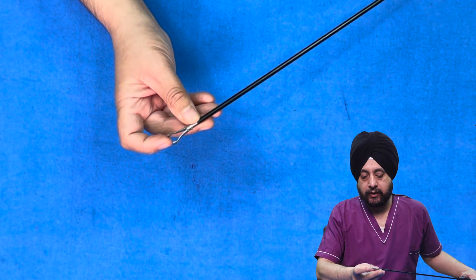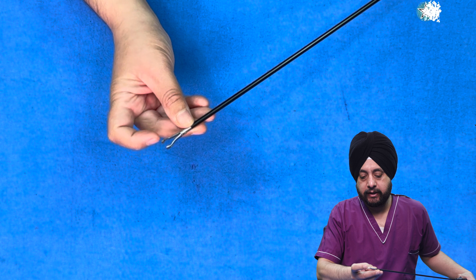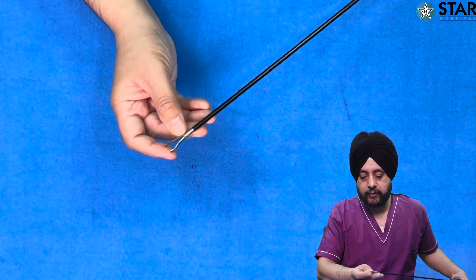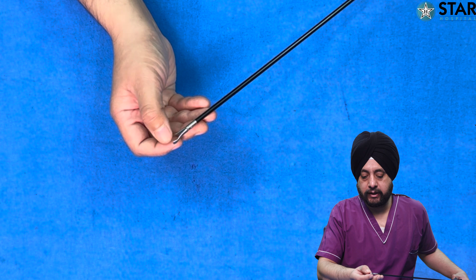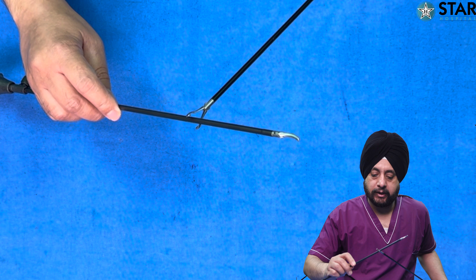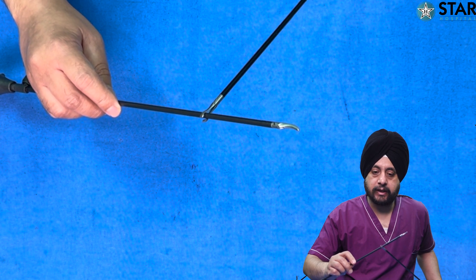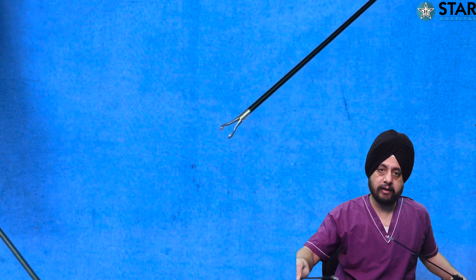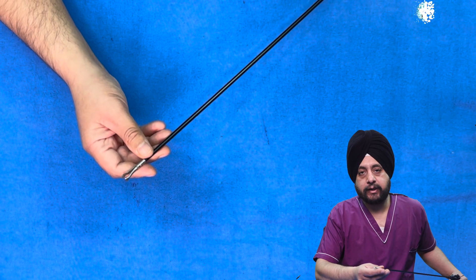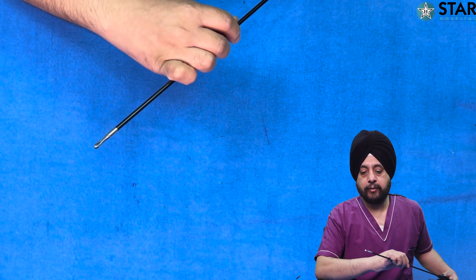This one is a laparoscopic Babcock forceps, where you have a grasping tip and a hollow space before it, so that when holding a tissue — like an appendix — it can come between the hollow part so you do not injure it and are just encircling it. This is like an open Babcock forceps, used for delicate structures where you want minimal trauma.